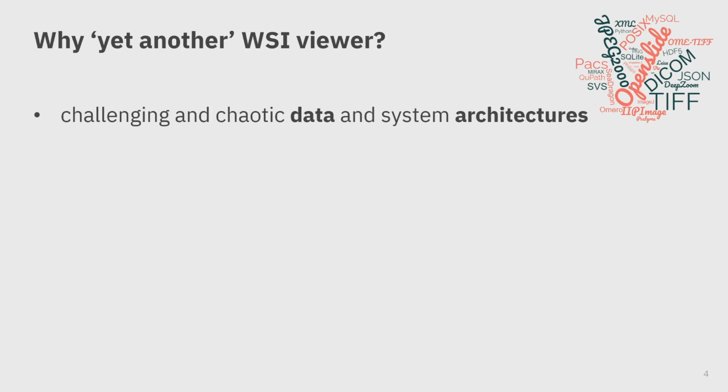The first problem we encountered with existing viewers is that WSI data is so large and complex to work with that historically the only standardized solutions are patented or proprietary. For larger WSI biobanks, a change in infrastructure is not a viable solution, and their architecture must be optimized for local requirements and budget, not for the viewer in use.